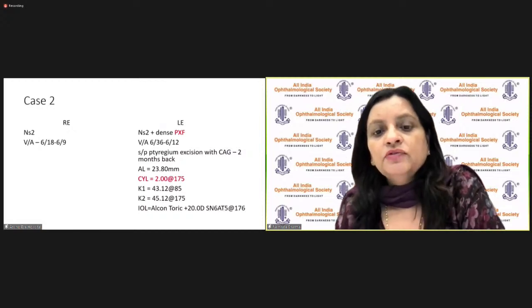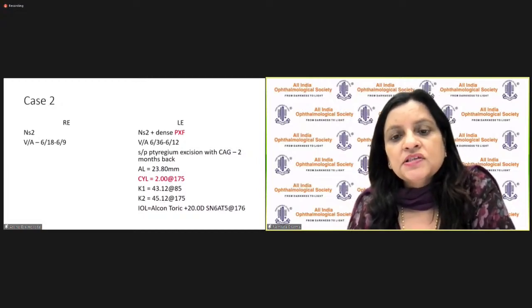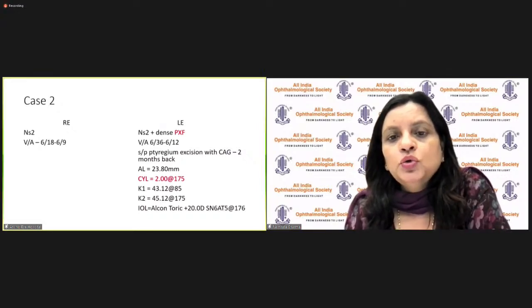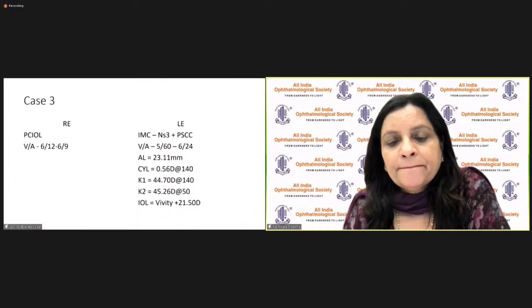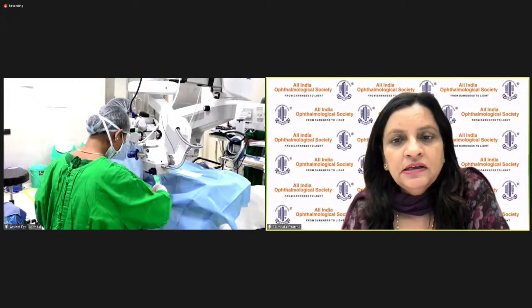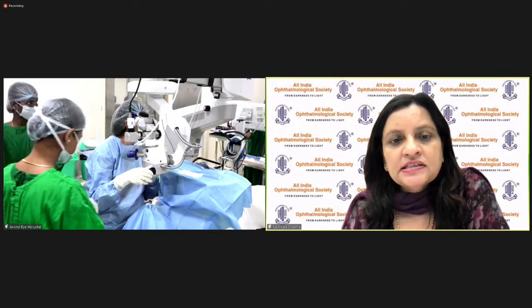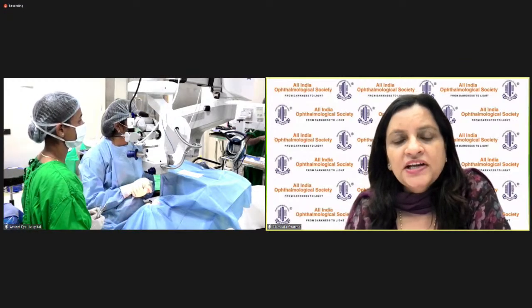I think this is very important: if you're planning a pterygium plus cataract surgery, you should first do the pterygium excision, allow the keratometry to stabilize, and then do the cataract surgery later. Axial length is 23.8, cylinder of 2, and we plan the Alcon toric intraocular lens with this. This is a question everybody asks: if there is a pterygium, when should you operate? Sequentially or simultaneously? Obviously, in this case, astigmatism is there, about 2 diopters, and the pterygium would also have caused astigmatism. So if you try to address that simultaneously in one sitting, you may be a little erroneous on the keratometry value. So we are ready, Haripriya?